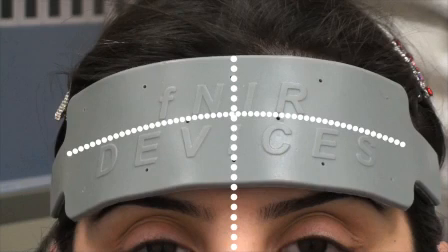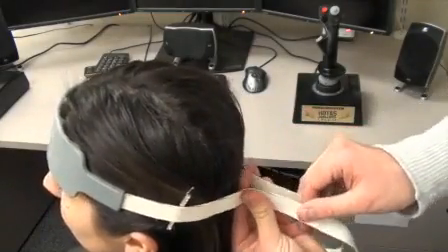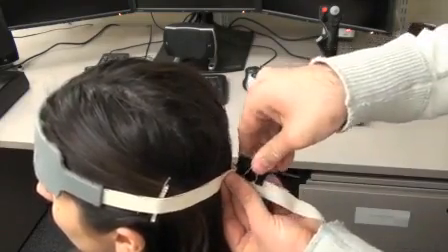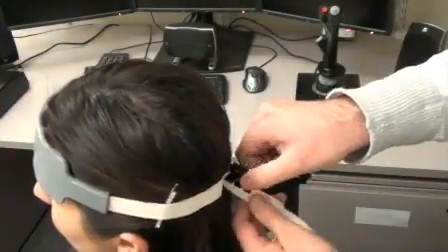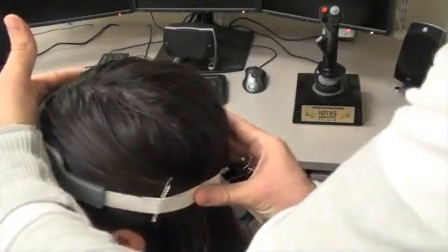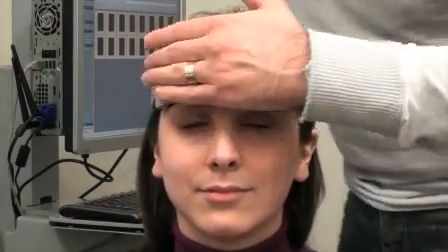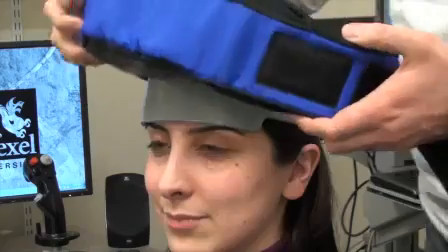Once the sensor pad is positioned, the cables are pulled on the 2 sides and connected at the back of the head with the cables secured with a clip. It is critical to check that the sensor pad is properly coupled with the skin and that there are no bumps or spaces between the optodes and skin. A good way to check for proper coupling is to apply a little pressure over the sensor pad and feel if positioning changes with pressure.